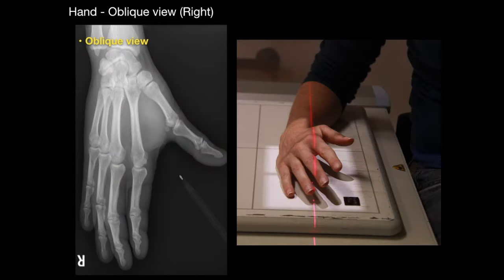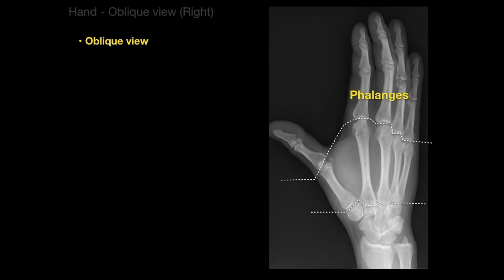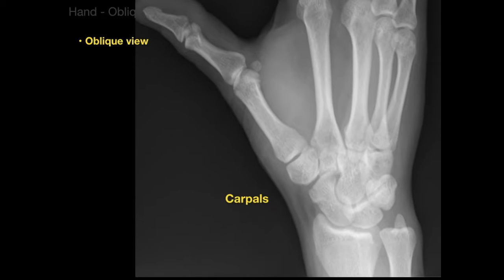The oblique projection of the hand is also good for looking at overlap. We can see the phalanges numbered one through five, and the metacarpals one through five, as well as the carpal bones, radius, and ulna. Zooming in on the carpal bones, we can identify them using our mnemonic — Sally left the party, there's the pisiform, take Kathy home — all the carpal bones outlined in this oblique view.